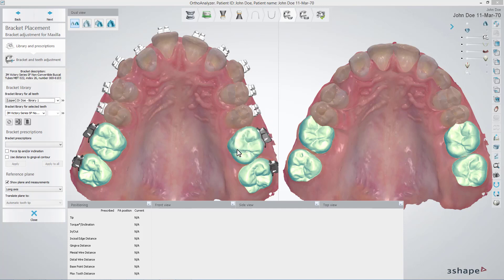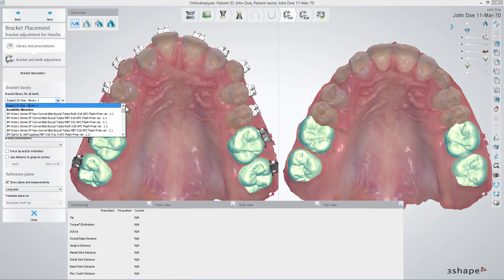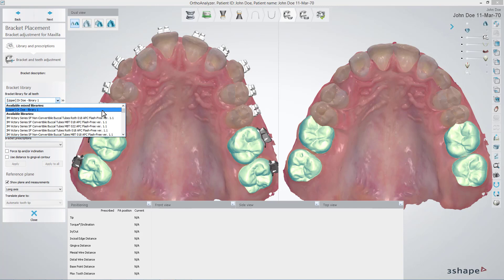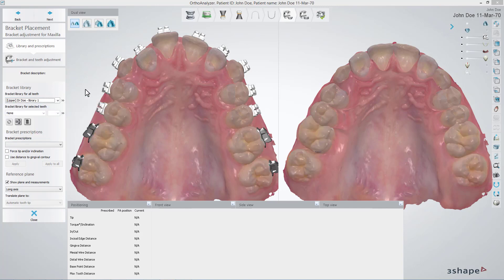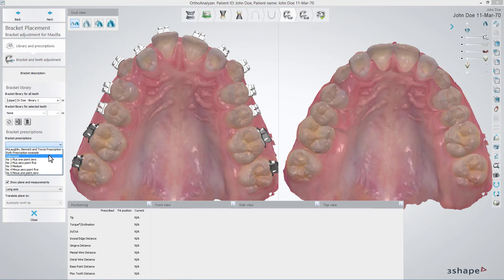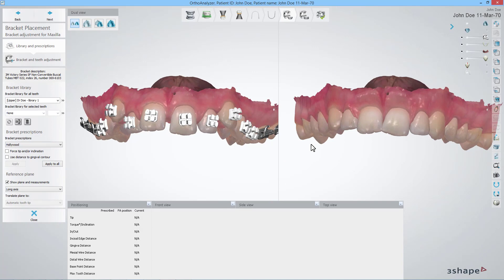Any libraries you compose on your own will appear at the top of the drop-down selection. Finally, you can also choose to use a placement prescription. Some are included in the software by default, but you can also create your own in the Author Control Panel. If you select a prescription, remember to click the Apply to All button — it will be applied to the initial placement.